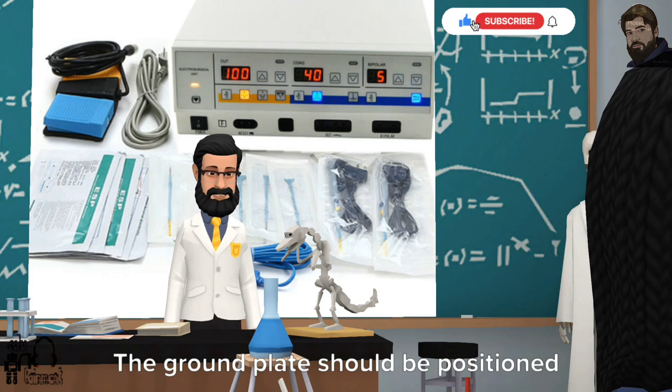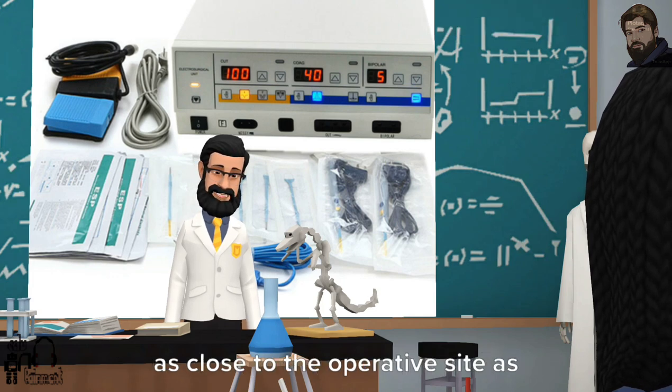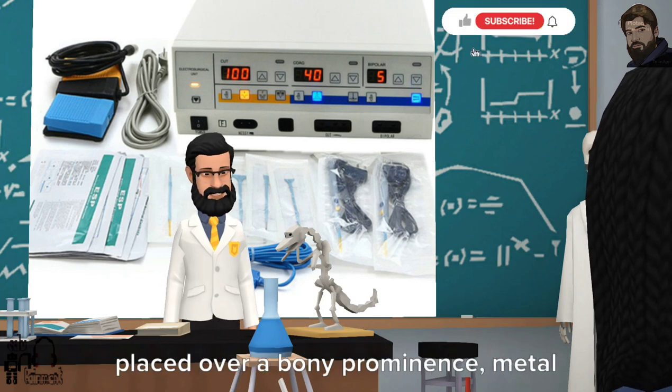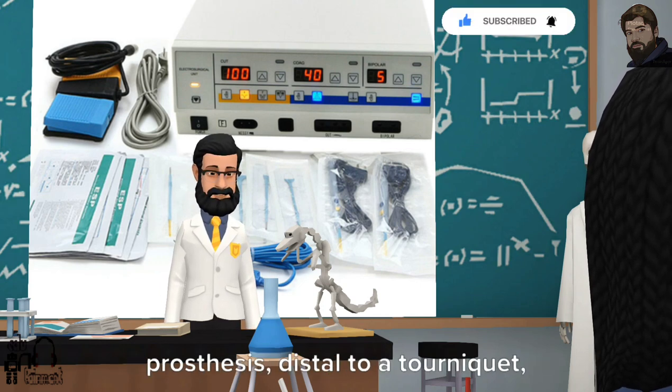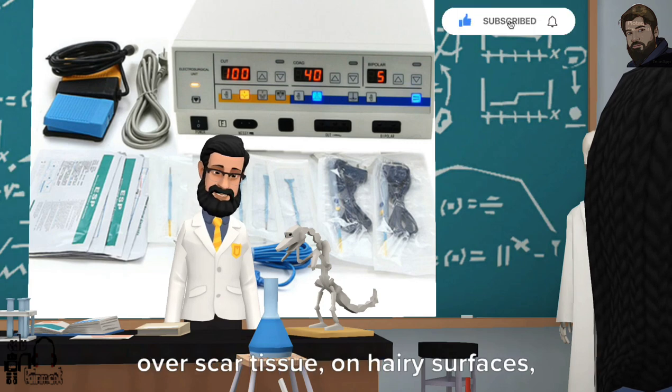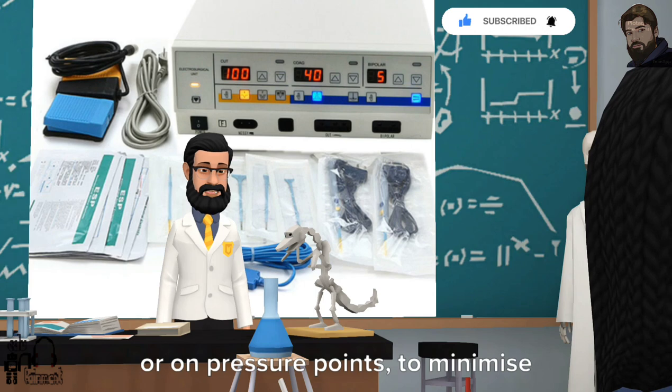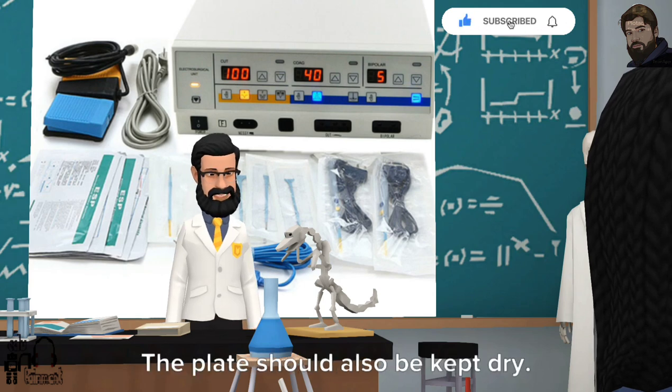The ground plate should be positioned as close to the operative site as possible, however it should not be placed over a bony prominence, metal prosthesis, distal to a tourniquet, over scar tissue, on hairy surfaces, or on pressure points to minimize the risk of burns. The plate should also be kept dry.